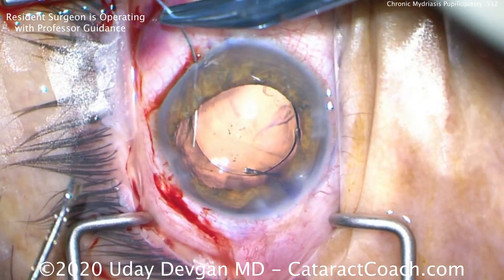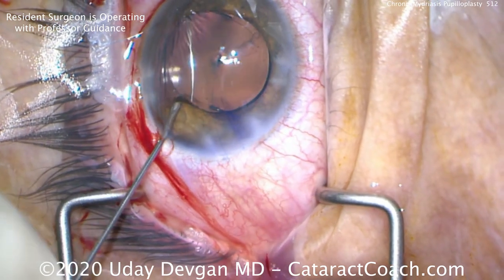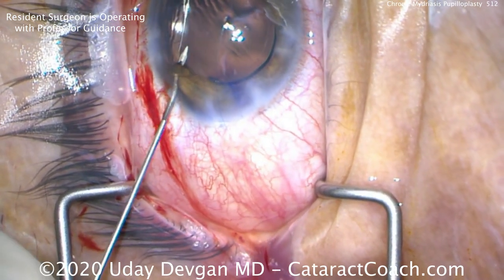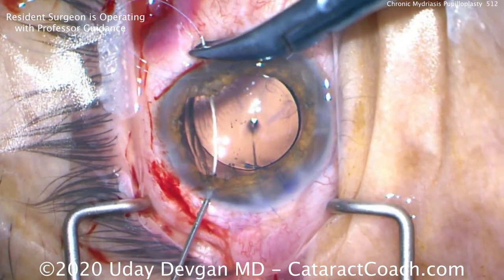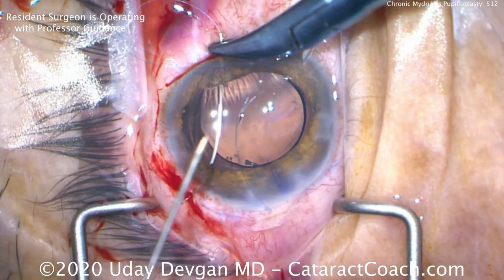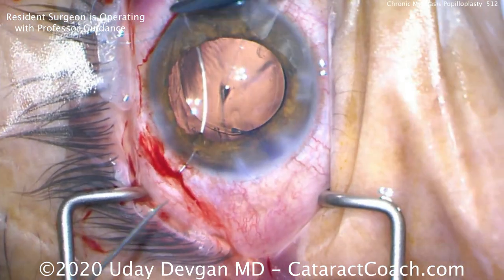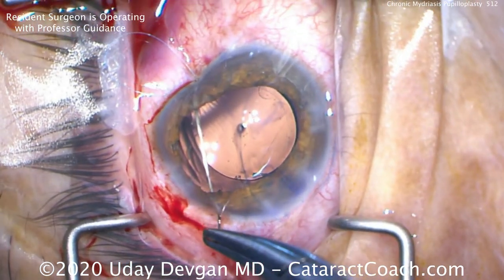Now for the second bite, we come across to the other side and go through a paracentesis using a 27-gauge needle, grabbing the iris just with that needle, and using the lumen of that needle to dock the 10-0 prolene needle. We can dock it there and pull it through — that's how we get this CIF-4 needle through the paracentesis. Now we'll pull it through and it comes through.